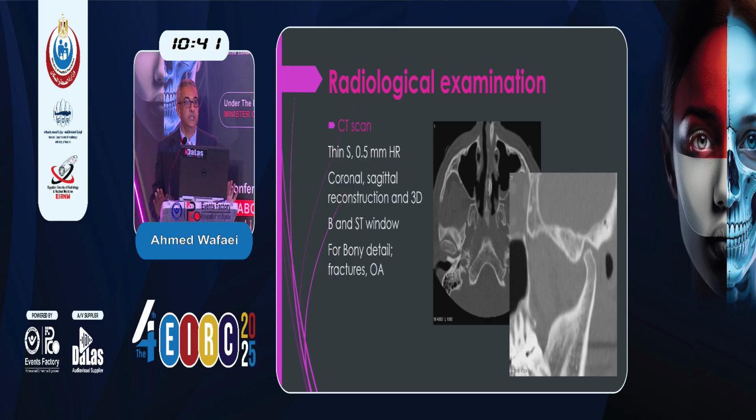And in temporomandibular joint evaluation, whether CT or MRI, the two joints must be done at the same time. And one of the important diagnostic factors is to compare the right to left to identify and to be sure about the diagnostic outcome.